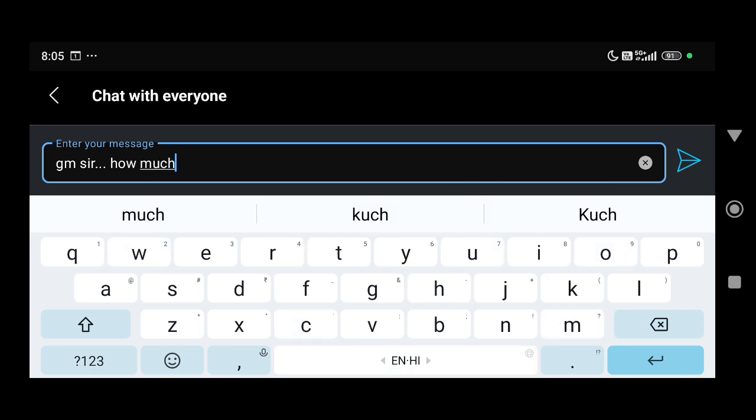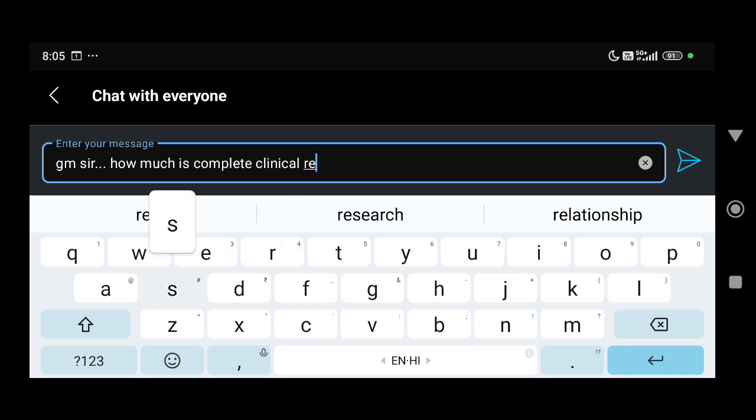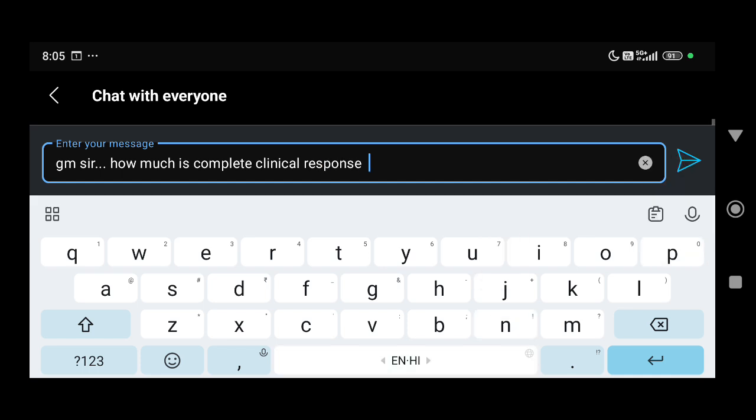In uncontrolled diabetes, if blood sugars are high, is it a contraindication? For FDG PET CT, it is yes. For FAPI, it is no. He can have a sugar drink and come to the department, and we can do the FAPI PET scan.